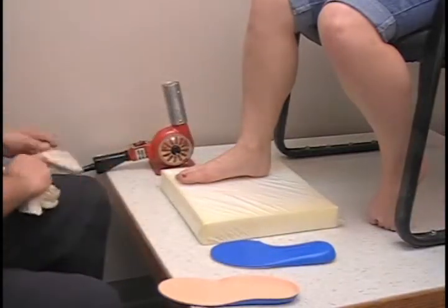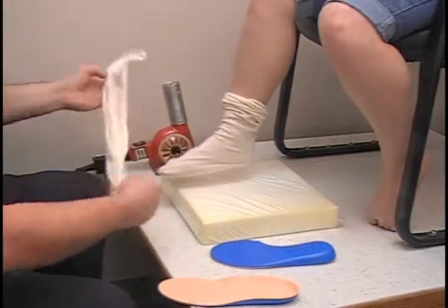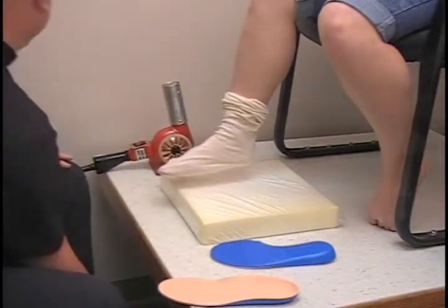I am going to put the sock on real quick. For her I am going to double sock them so there is a lot of protection.